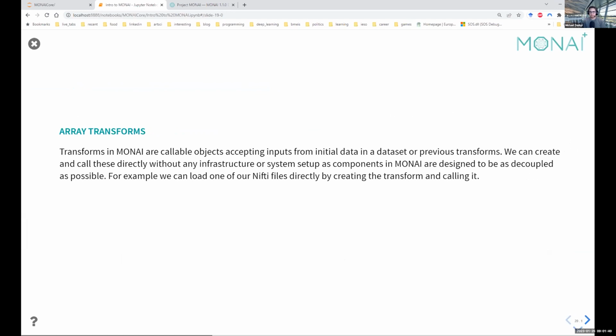Do you want to talk briefly about data loaders? Yes. Basically, it supports all of the usual data types. You can also just bring in tensor data or numpy data. Yeah, it's very flexible. And even if it wasn't, remember, because it's built on top of PyTorch, you could just interleave loaders from other libraries, or you could even just roll your own using whatever loader you want to use.